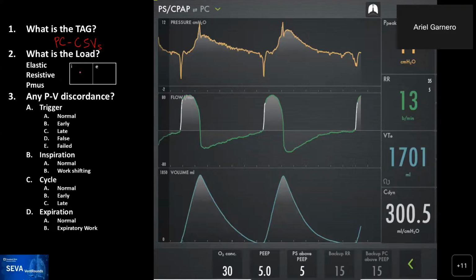And Eduardo, do you think there is a risk for a post-op or for a post-cardiac arrest patient with normal lungs to be breathing tidal volumes this big?